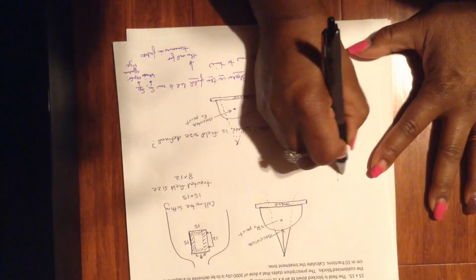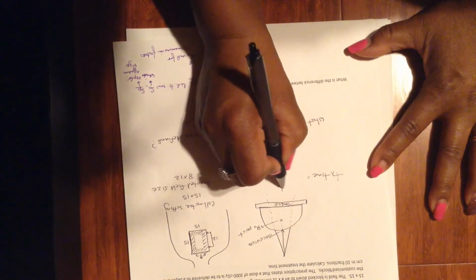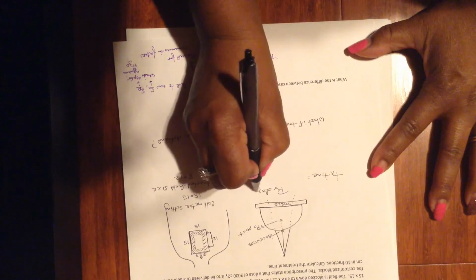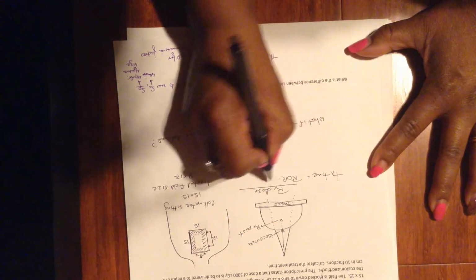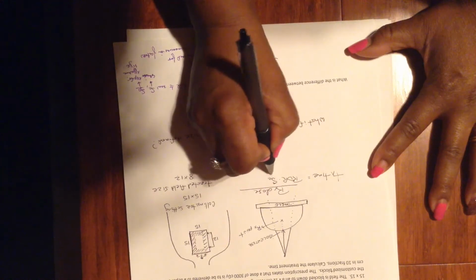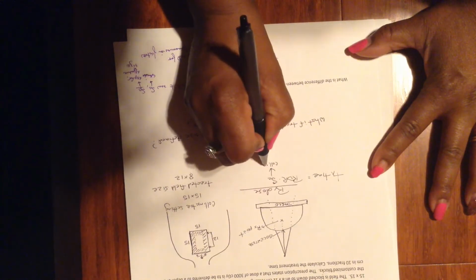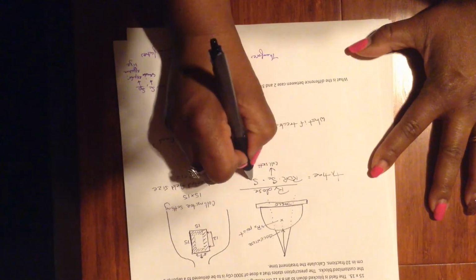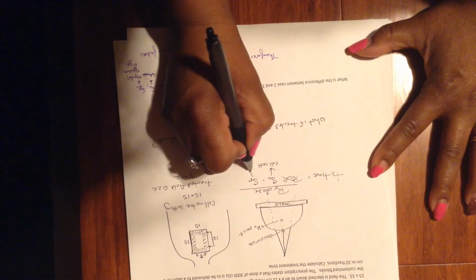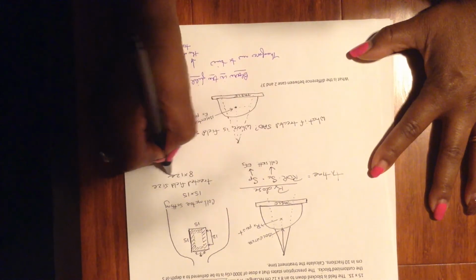This time when we calculate the treatment time, this is going to look like this. The prescription dose on the top. Then we're going to find the reference dose rate. Then we're going to find the collimator scatter, and the collimator scatter is going to be for the collimator setting. And then we're going to find the phantom scatter, except the phantom scatter is going to be for what we call the effective field size. This is the effective field size.